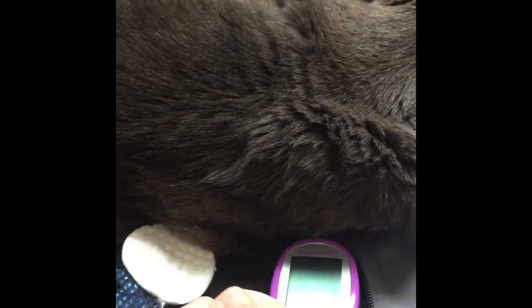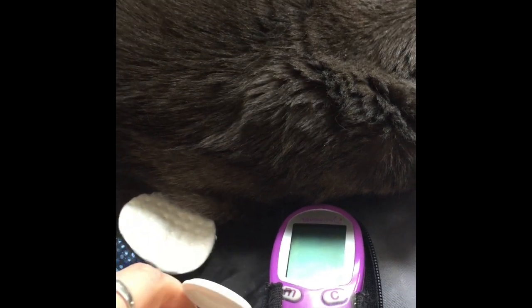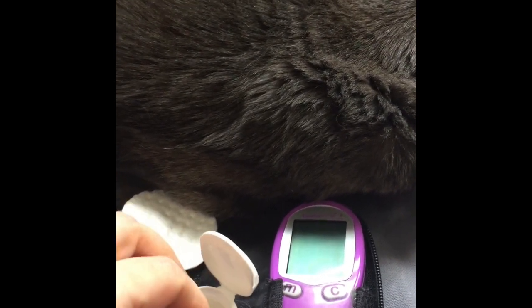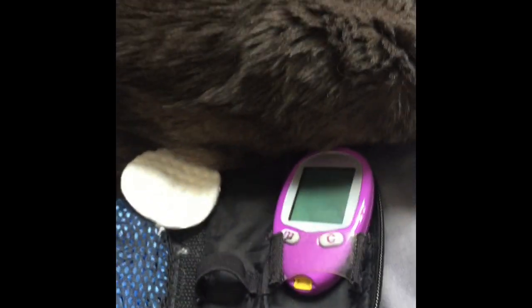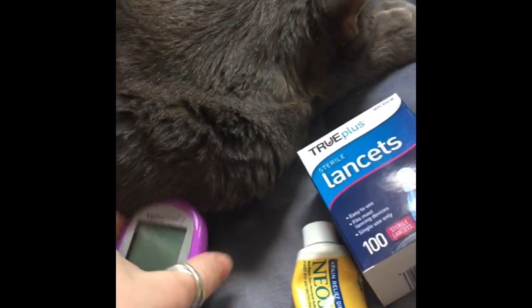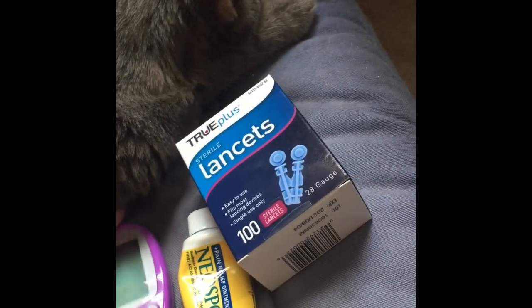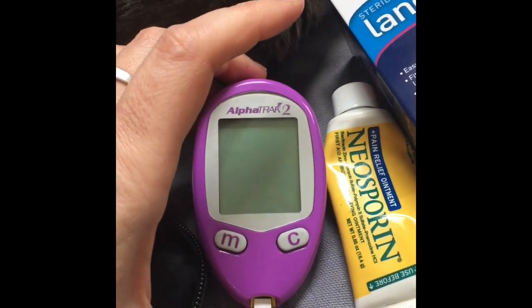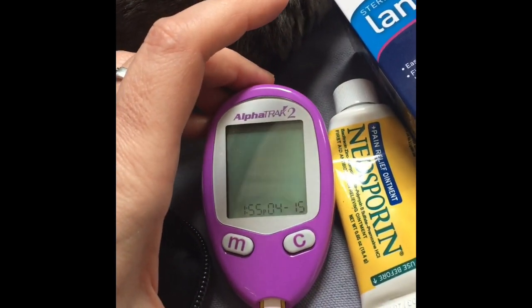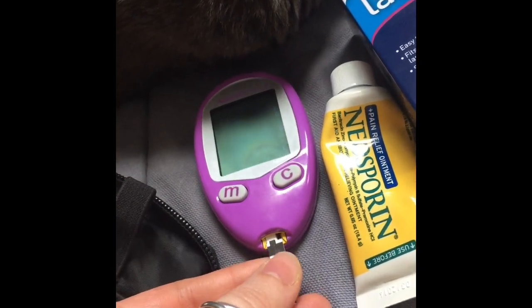So that's what's inside my kit. I'm going to go ahead and pop this open and pull out a strip. What I do is I stick the testing strip inside of my meter without pushing it all the way in. When you push it all the way in, it starts the countdown. You've only got like 30 to 60 seconds to get your sample. So I wait until I actually have a drop starting to form so that I don't feel rushed.